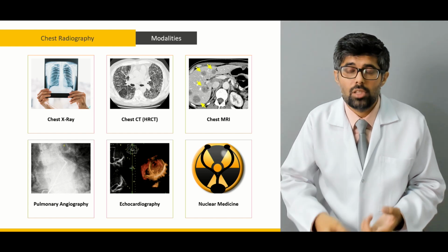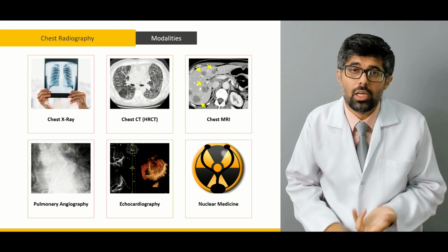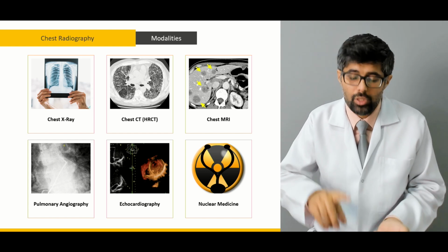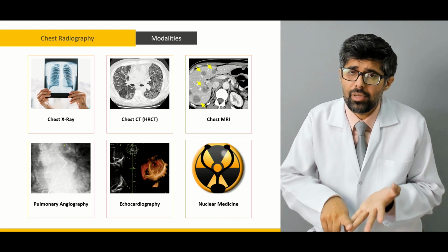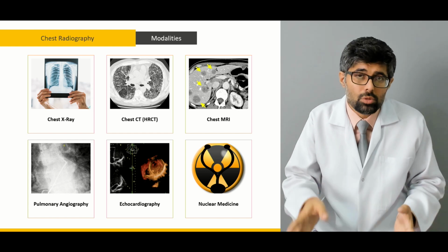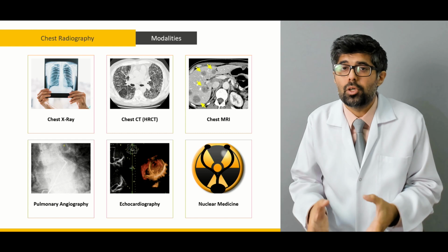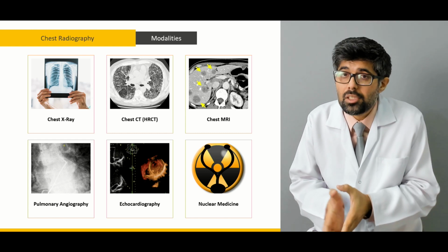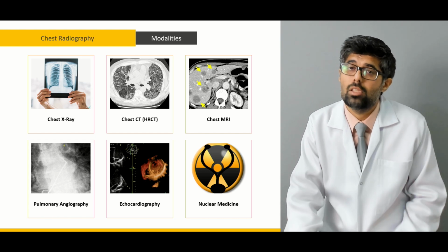It tells us how the perfusion is working, how the ventilation is working, how good the heart is working, how good are the pulmonary veins or the lungs are working. So it gives us both the ventilation and perfusion and the working of the heart. And it is done through the thallium or the radionuclide study, the nuclear medicine.